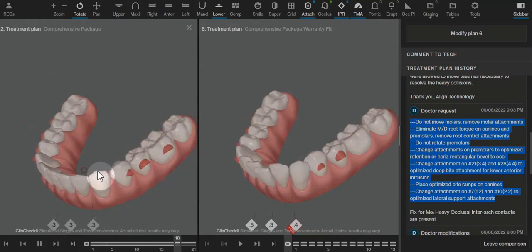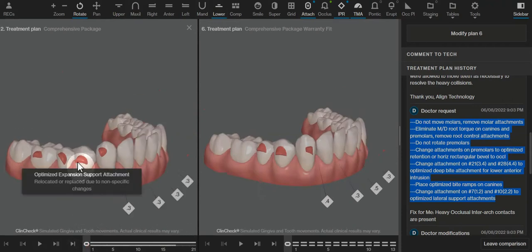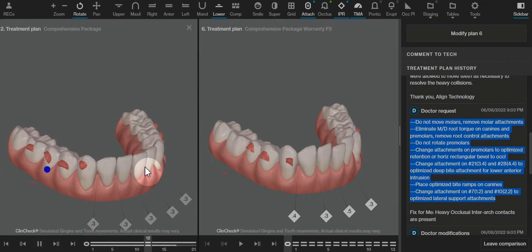I like this optimized expansion support attachment. It works really nicely for a retention attachment, so the aligner is well engaged with the arch. When the aligner is well fitting all the way through the arch, every other movement that we're trying to do, like correcting lower rotations or intrusion, is going to be more predictable.